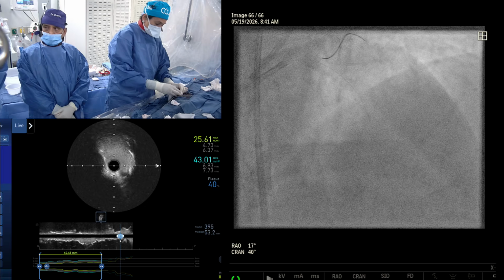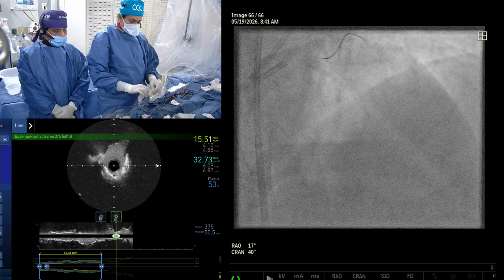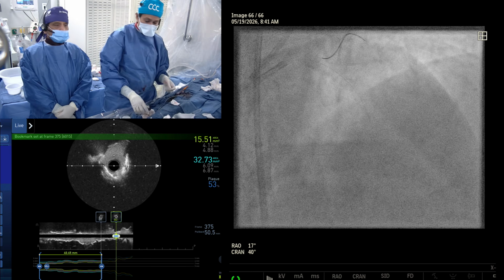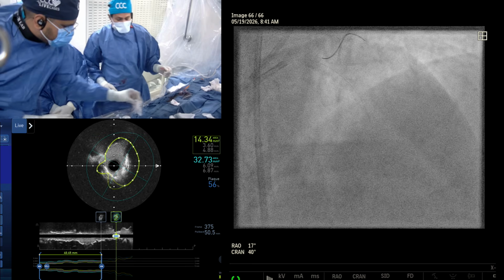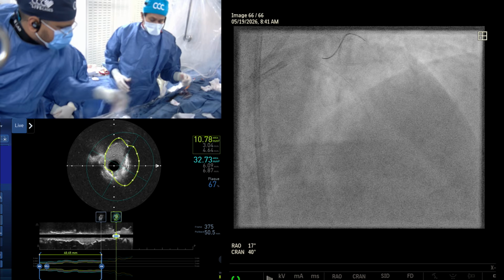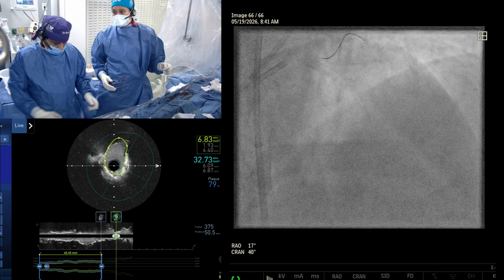One thing they are also saying is that if there is a long lesion between tandem lesions and you're doing IVL, in the non-calcified area nothing happens. But I think that's not what we are seeing.